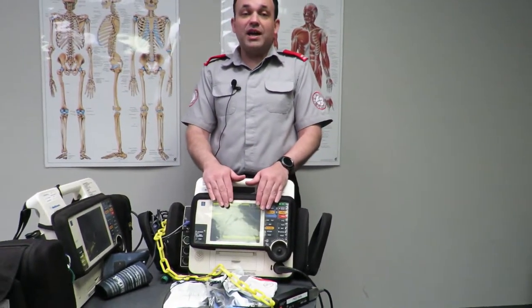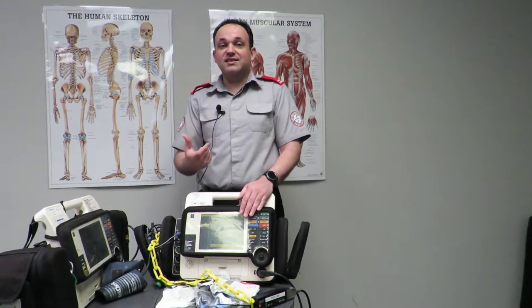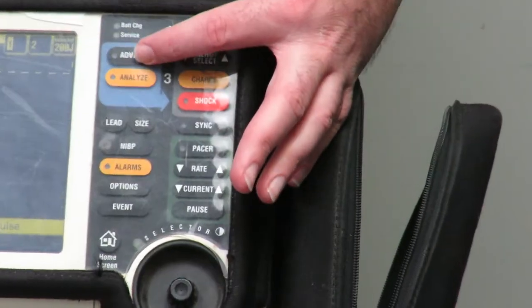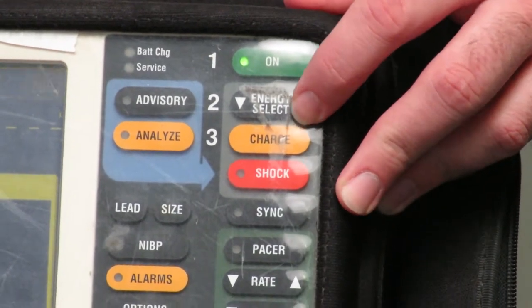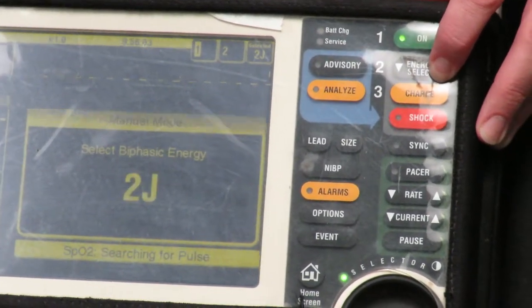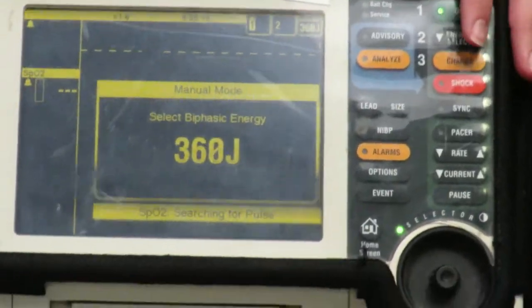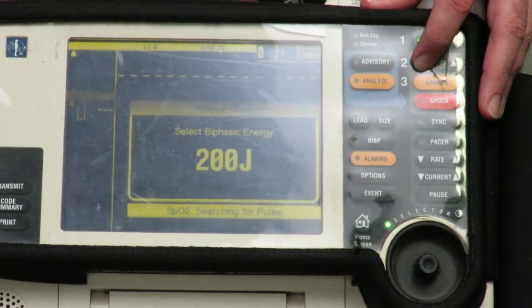We're going to use the defib in manual mode to initiate a charge, test into the load, and get the printer to print out to confirm the charge was successfully delivered. Make sure the unit is in manual mode by ensuring the indicator lights are off. Use the energy select button to select 200 joules. The unit is capable of delivering from 1–2 joules up to 360 joules. These test loads are only designed to take 200 joules maximum, so we use the maximum allowable test load of 200 joules.